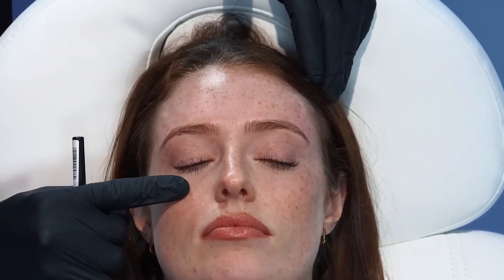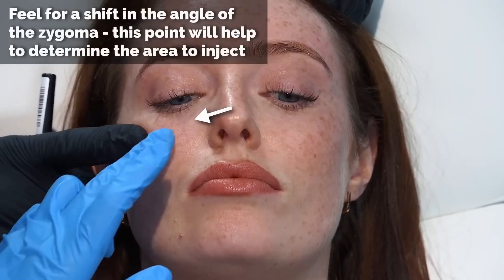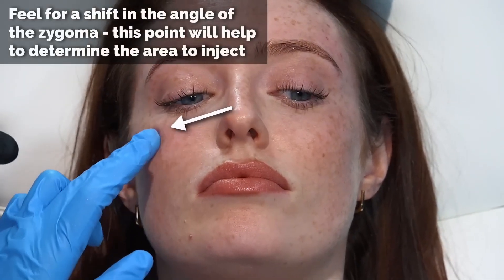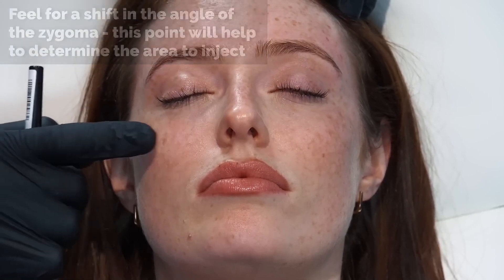Whenever you're thinking about how to inject, think about where the surface of the bone is. If you feel along the bone, you can feel it quite easily, and over time you get a feeling for which direction that bone is facing. You can also check before you inject - you can feel the direction of the zygoma very easily, feel the angle of it. There's definitely a shift in angle that's very easy to find. The main thing from an aesthetic perspective is to know where the angle of the cheek is and which direction you want to change it.